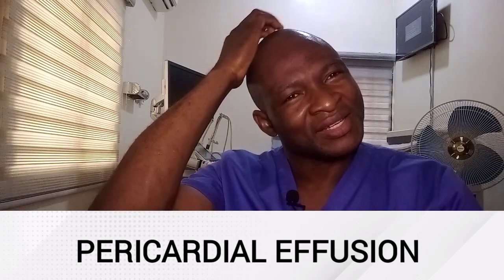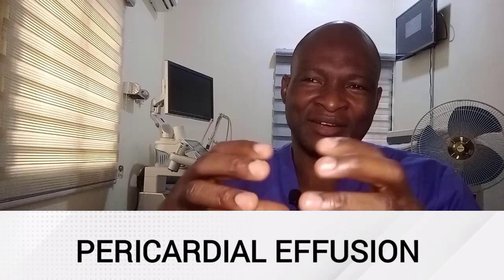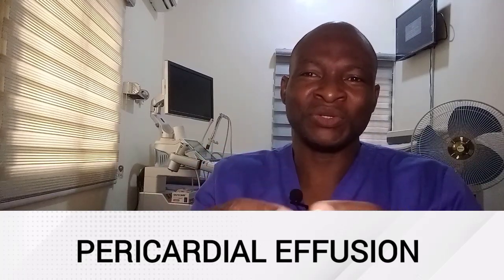Then a pericardial effusion, this is anechoic fluid collection around the heart in the pericardial cavity, and this can also be noted during abdominal sonogram.